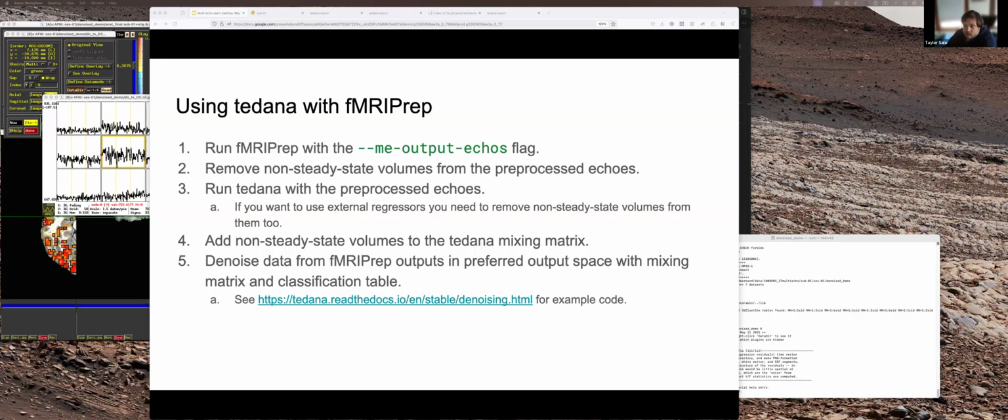I'm sorry if I butcher your name, Nayun. What is the difference between using tedana on AFNI versus fMRIPrep? None. I mean, tedana is getting run the same way internally.